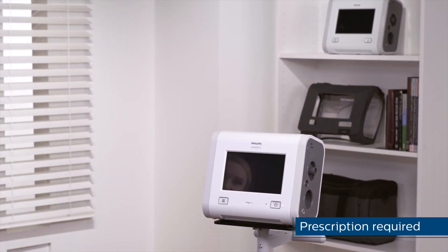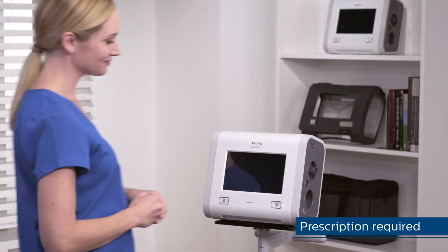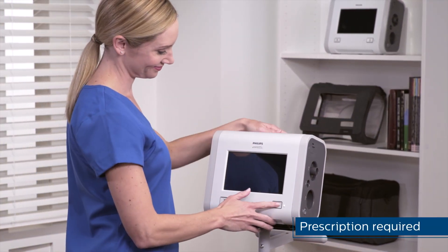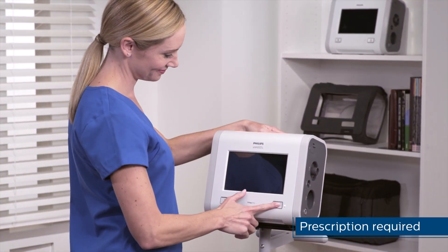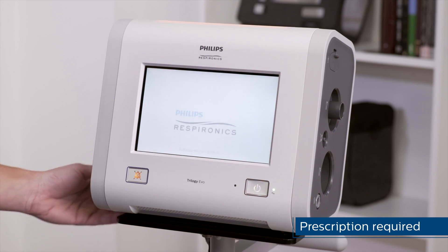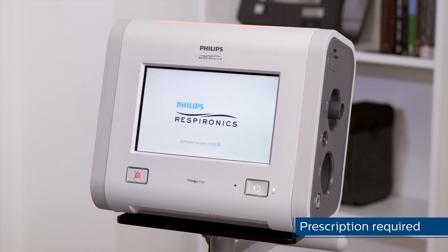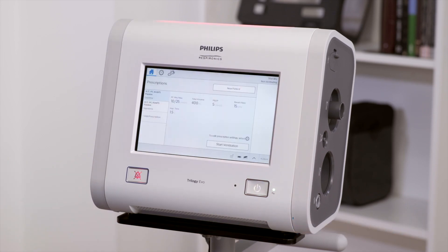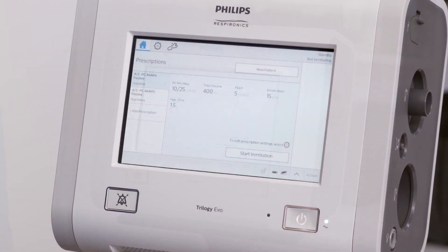Trilogy EVO has been designed with an easy-to-use touchscreen interface. In this video, we're going to demonstrate window navigation and some important functions, including info help, battery information, monitoring views, and changing prescriptions.